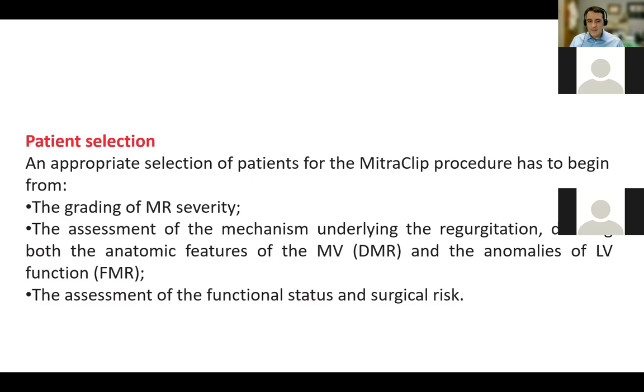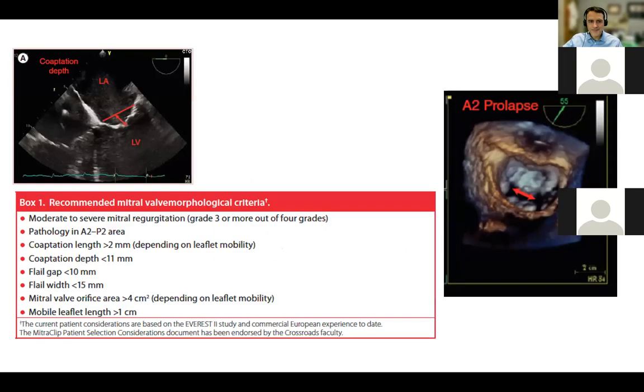And obviously to meet that patient, to really get a good assessment of obviously, are they a surgical candidate first? And if they're a surgical candidate that is reasonable, then surgery is often the primary way to go. And if they're not, what is their functional status? What is their surgical risk? What is their percutaneous risk? Are things that we assess.